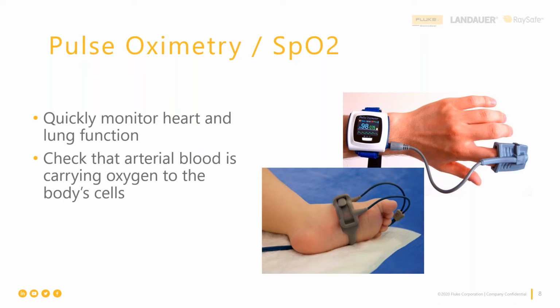That was the first place. So you may see a little pinch clip that would clip onto the ear. That was for an ear oximeter, a measurement at the ear. So fingers, toes, heads, and earlobes, if you're thinking about where we make these measurements.